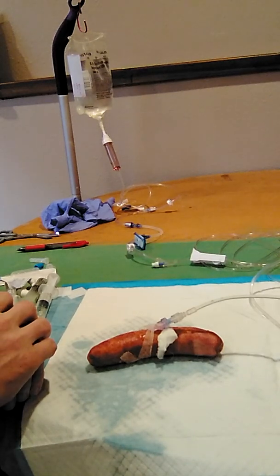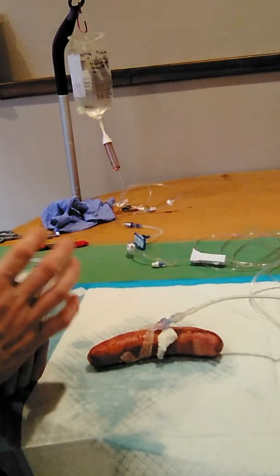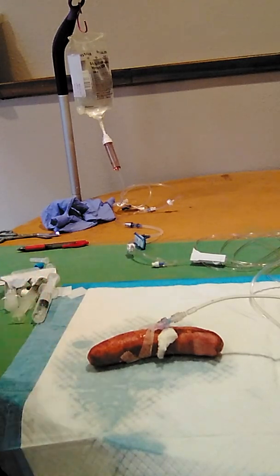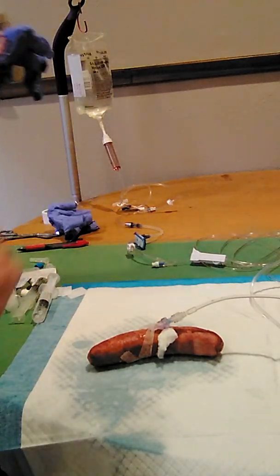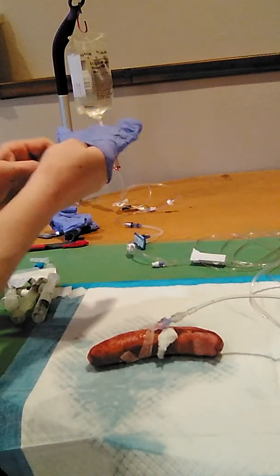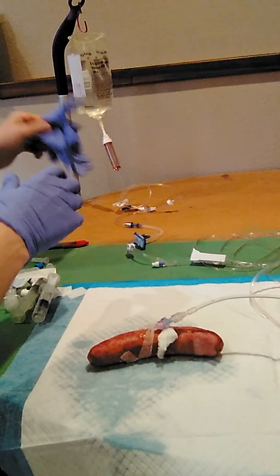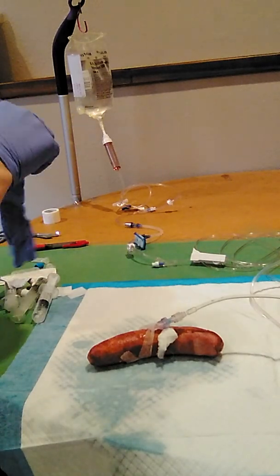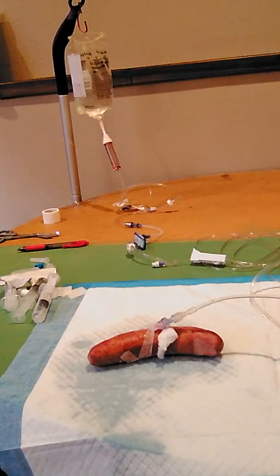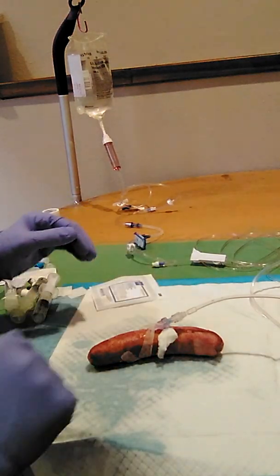Now, we have to show you the last aspect of this, which is discontinuing an IV infusion. So I'm going to don some clean gloves. Okay.